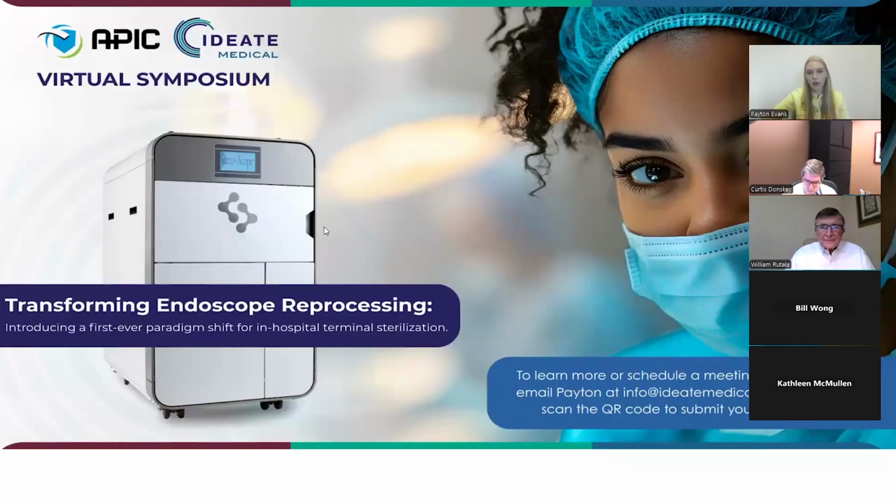Joan had a great question. Are there any occupational risks? Anybody can answer this. I guess I could try and take a pass at it. One of the beautiful things about any hydrogen peroxide sterilizer, when you really think about it, is that the only requirement for the system is really electricity to run the system.